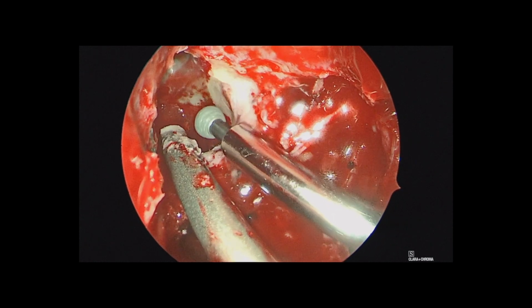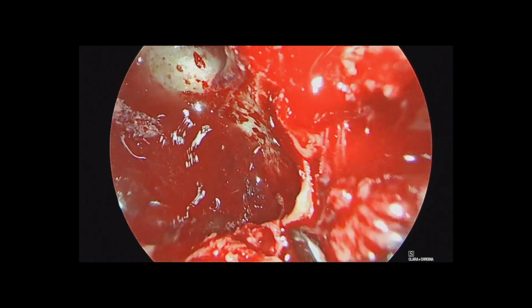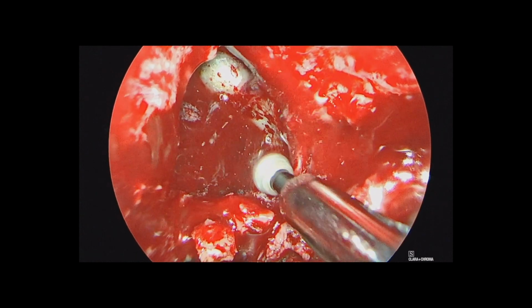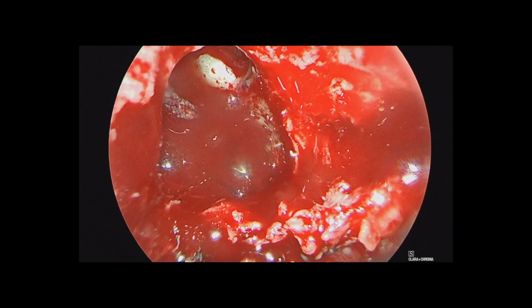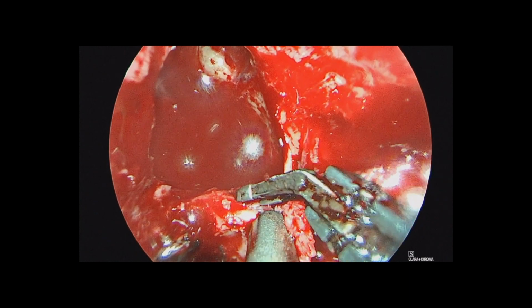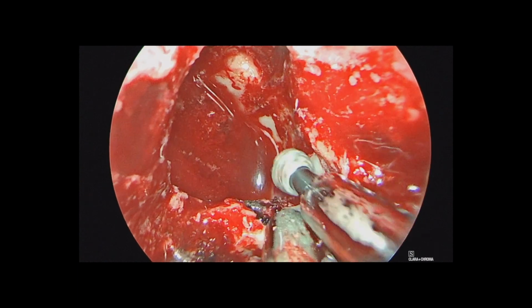Meticulous drilling here over top of the foramen rotundum is really important, and here you can see us mobilizing the area between the Vidian nerve as well as V2 as it tracks back towards rotundum. Here we are drilling out that bone of the pterygoid wedge between the two, between the Vidian nerve and foramen rotundum. You can see a bit of bleeding there from the artery in the pterygoid canal, the Vidian artery. So we'll go ahead and address that with bipolar cautery here as we continue to drill and remove bone here.